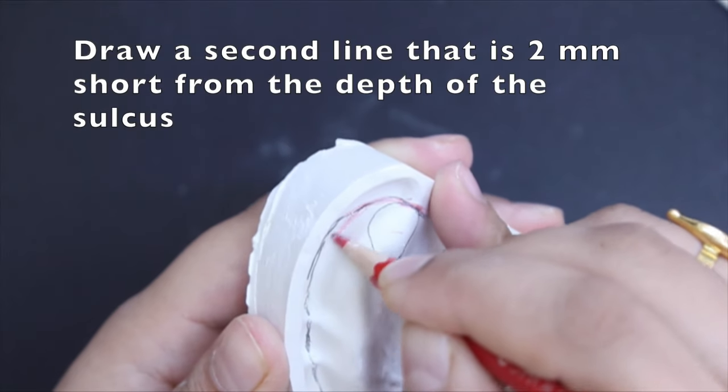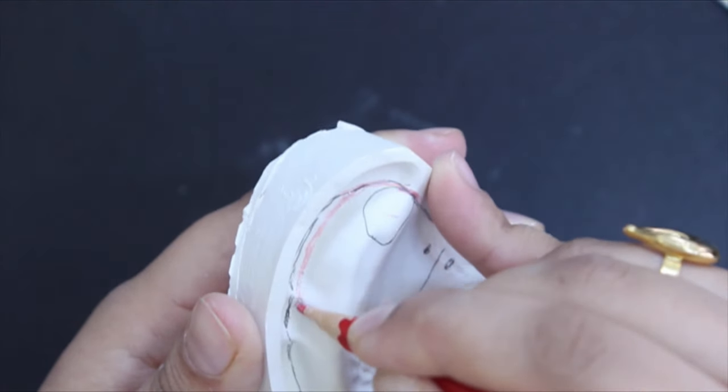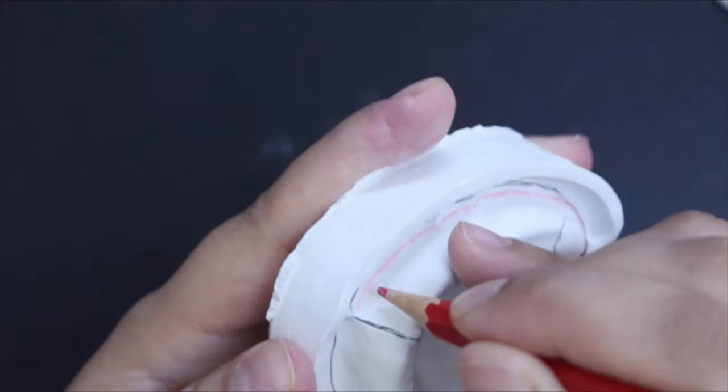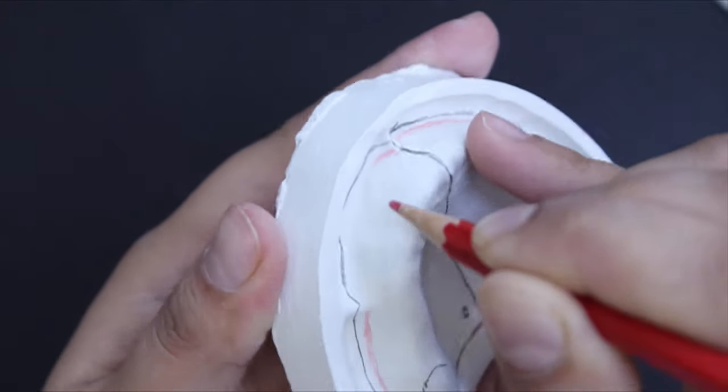Next, draw a second line that is 2 mm away from the depth of the sulcus. This is to leave room for the tracing compound during border molding. Note that the two lines meet at the distal end of the denture bearing area.